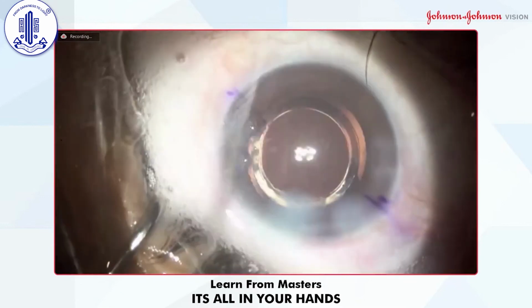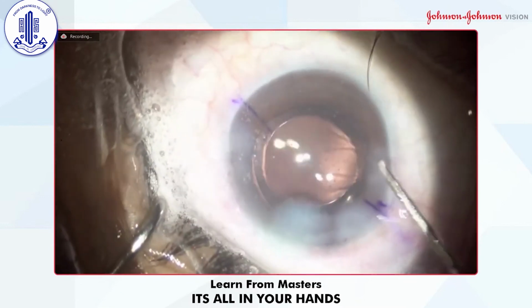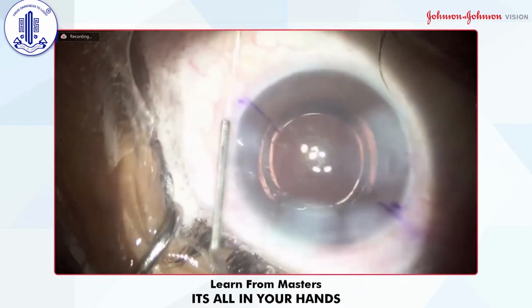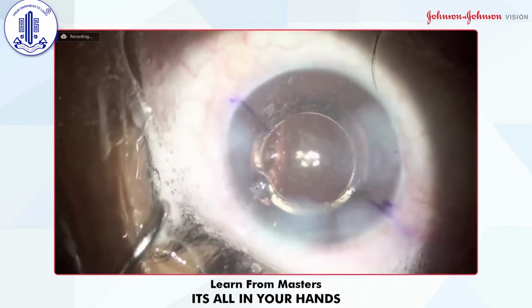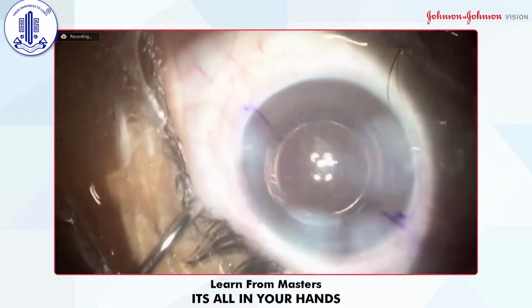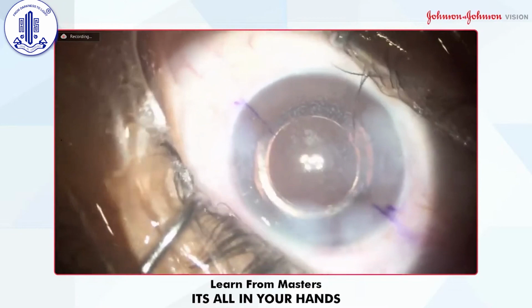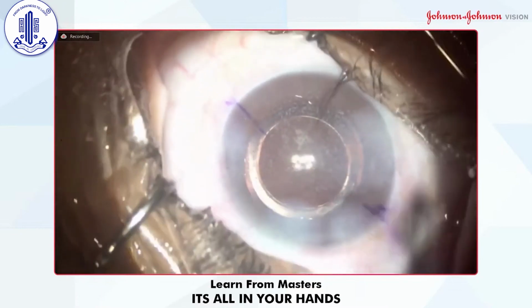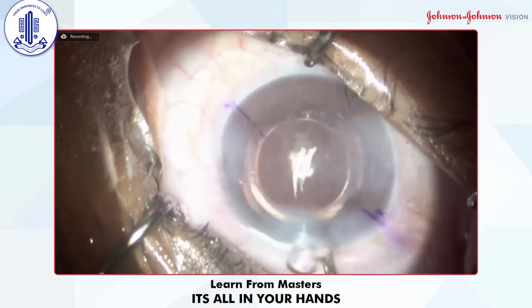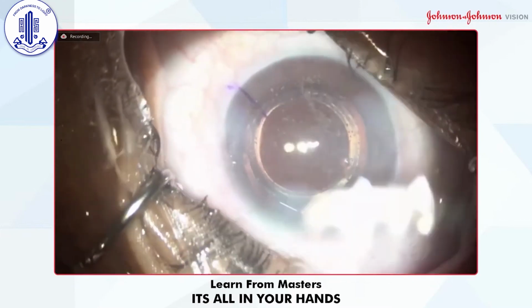So making this hydration through completely. Okay, good. Now what I do is I release the speculum and lift it a little bit up.